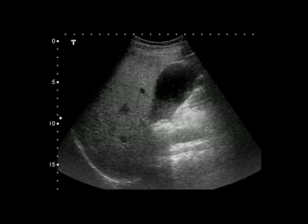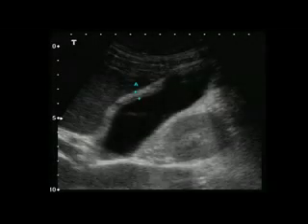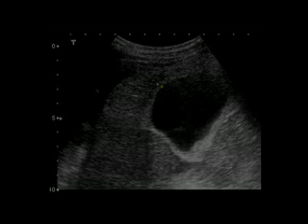A structure in the gallbladder neck that casts a shadow needs to be thoroughly evaluated to determine if it is a stone or an incidental finding, such as bowel gas or a valve. Visualizing a gallstone does not necessarily mean that the patient's symptoms are being caused by biliary colic. The findings in cholecystitis include thickened anterior wall greater than 4 millimeters, pericholecystic fluid, and/or a transverse diameter greater than 5 centimeters. Some bacteria will cause an emphysematous wall, necessitating immediate surgical intervention.